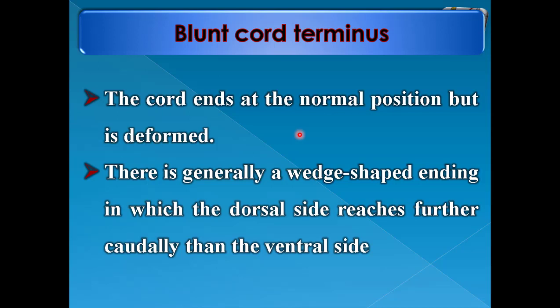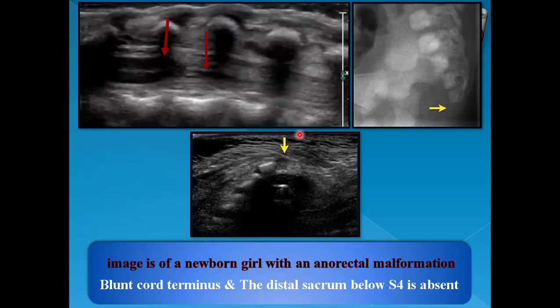Blunt cord terminus: the cord ends at the normal position but is deformed. There is generally a wedge-shaped ending in which the dorsal side reaches further caudally than the ventral side. The shape of the lower end of the conus medullaris is deformed, with extension of the dorsal aspect more than the ventral. This is associated with caudal regression syndrome with absent distal sacrum — below S4 there are no vertebrae and the coccyx is also absent.